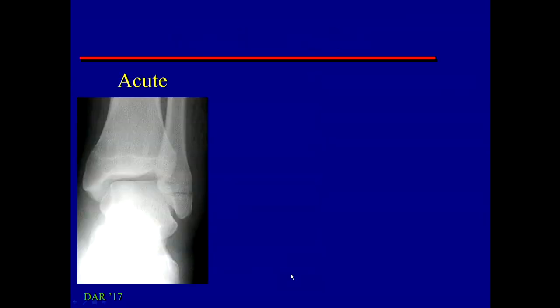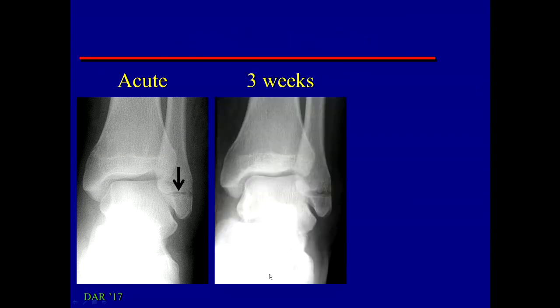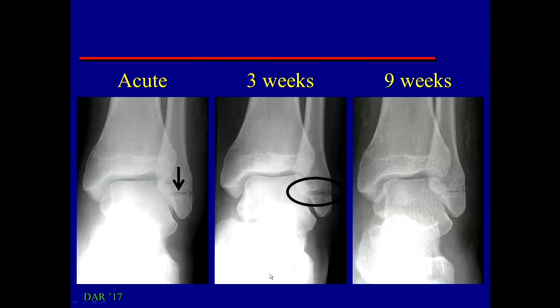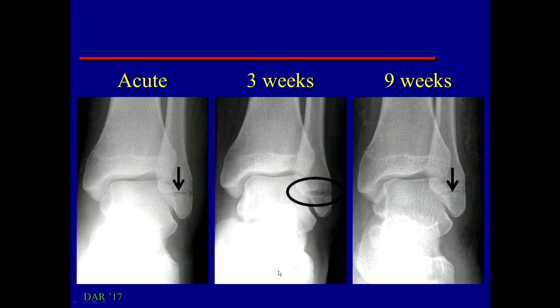At this stage, we can't tell if healing is normal or abnormal — we follow it over time. Here's a lateral malleolus fracture. Initially at three weeks, that fracture line is getting wider, so we don't know what's going to happen. But at nine weeks, we can see normal fracture healing starting to narrow down again, and that will go on to heal.